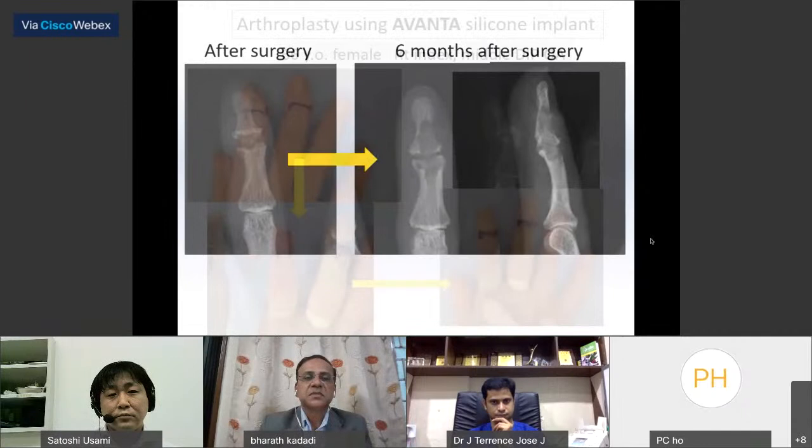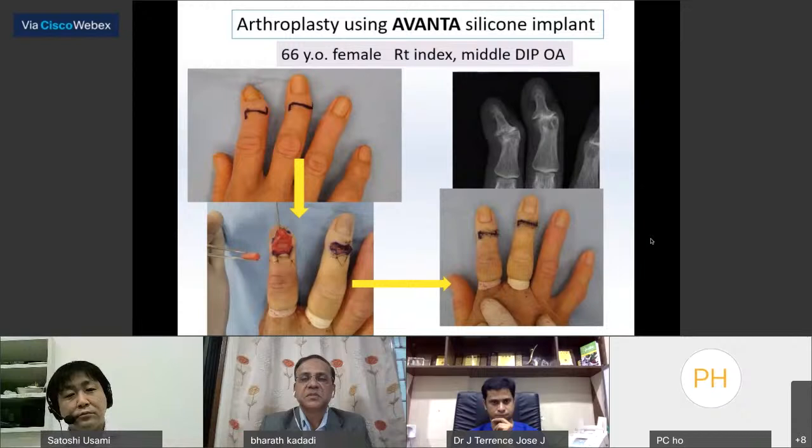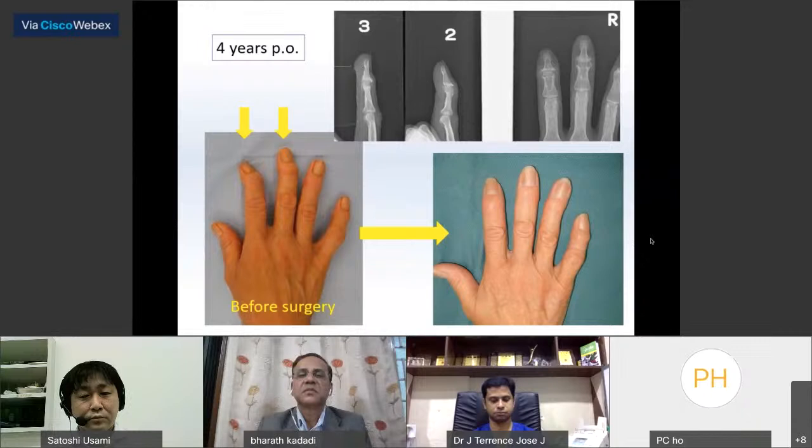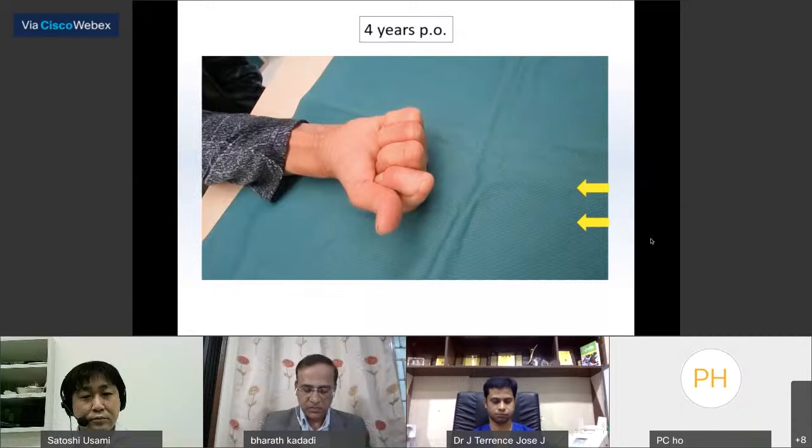I am going to show the case reports. A 66-year-old woman complained of her right index and middle DIP joint deformity and pain. She underwent DIP arthroplasty using the Avanta implant for improving appearance and pain. At 4 years after surgery, the radial deviation of her finger was corrected with great satisfaction. This is the active range of motion after surgery at 4 years. Her DIP joints are useful for skillful work.